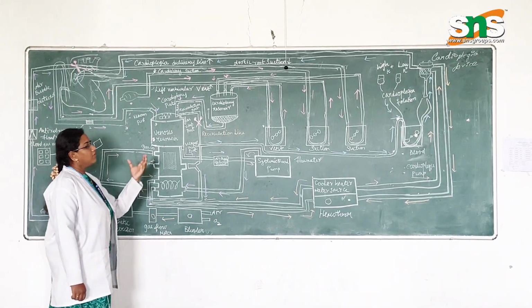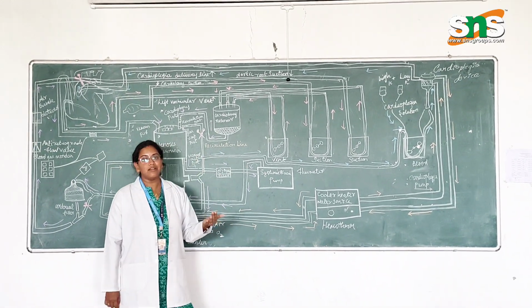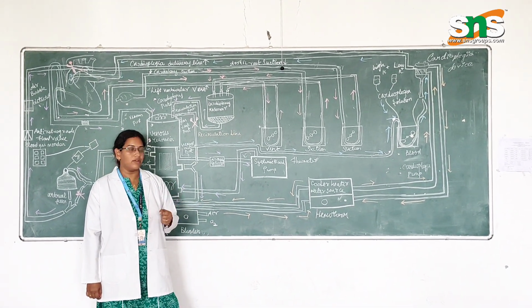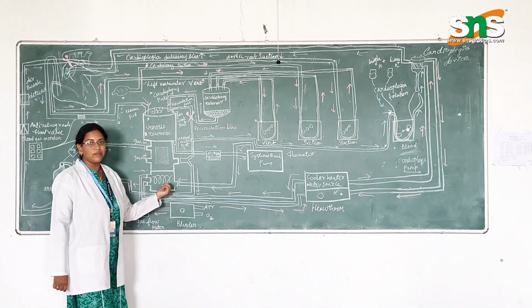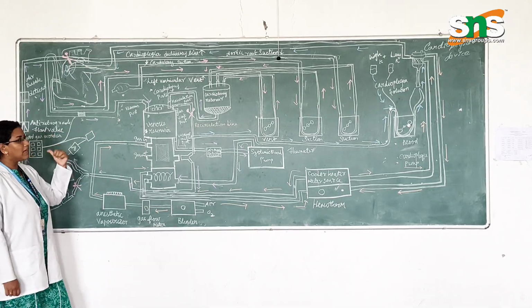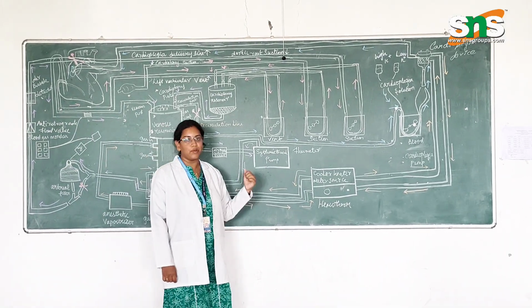Another important factor is the systemic blood pump. The systemic blood pump can stop at the bed of bypass because of any failure of the console. If that happens, it cannot push the blood from the reservoir to the heat exchanger. Automatically, the flow you are giving to the patient will get drastically reduced. This leads to systemic hypoxia and systemic hypoperfusion.